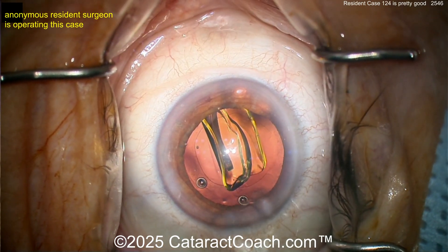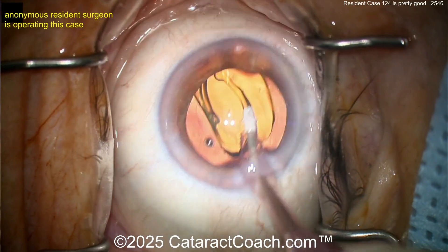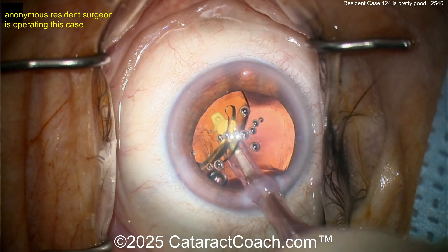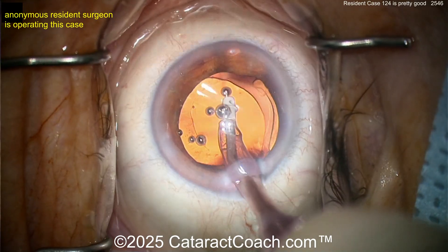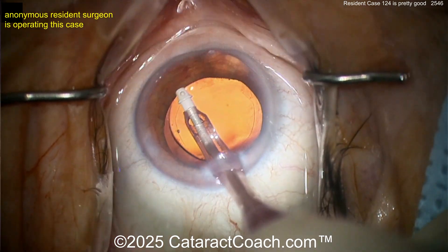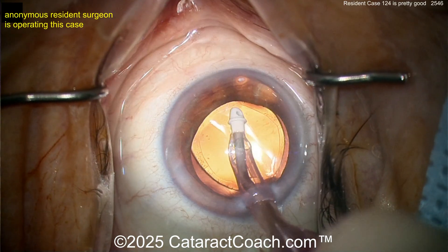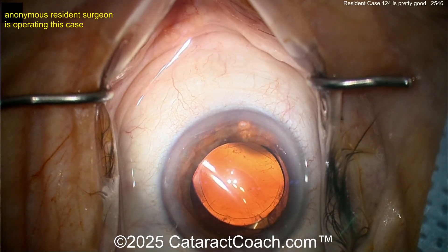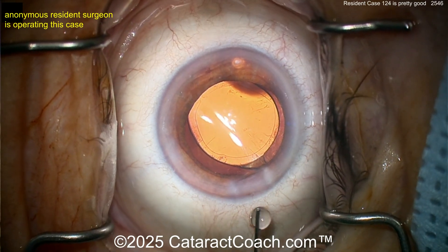Good job — you must have watched the video from earlier this week about appropriate wound assessment. I like to get the lens in the bag more with a second instrument, but you can use the I/A probe. Now removing viscoelastic from behind the lens — that's a good move, especially when you start doing toric lenses. Beautiful job. My advice: there were times when the eye wasn't in primary, so try harder to keep it there. Your rhexis should be a bit more advanced — keep working on it.